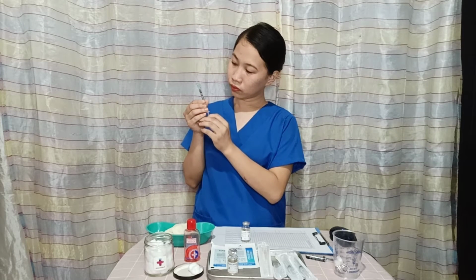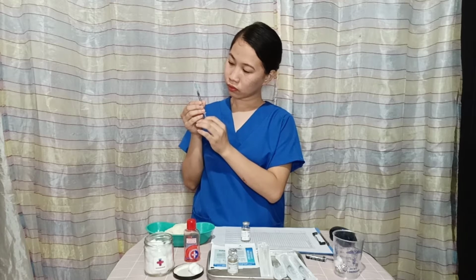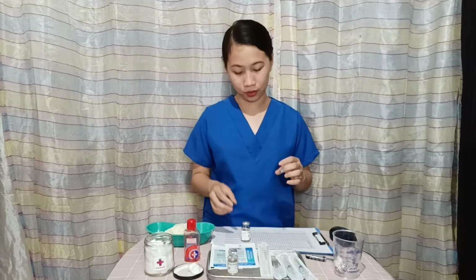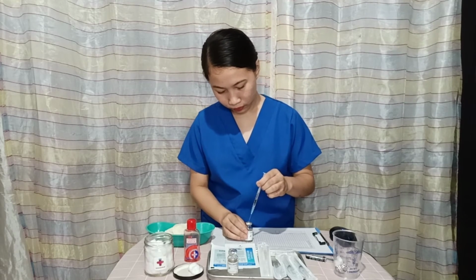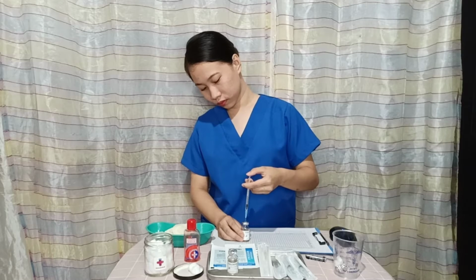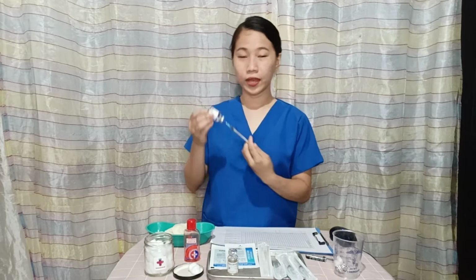Withdraw some air inside the syringe. The volume of air that needs to be drawn inside the syringe is equal to the amount of medication as ordered by the doctor. Then, after that, inject the air into the vial. Then next, invert the vial and withdraw the exact amount of the medication needed.